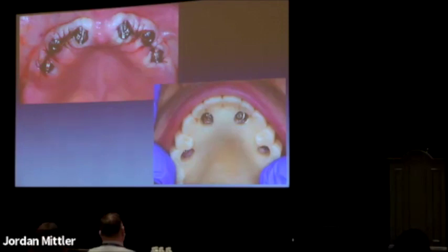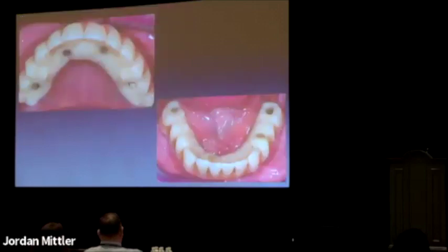Now we're starting to transition this patient to something that feels a lot more like a fixed prosthesis rather than having to be in these immediate dentures. Again, I'd love to never give a patient an immediate denture, but in a situation like this, there's almost no choice because I think the risk of putting immediate implants in those infected tooth sites is just not worth the risk. Okay, the converted dentures.